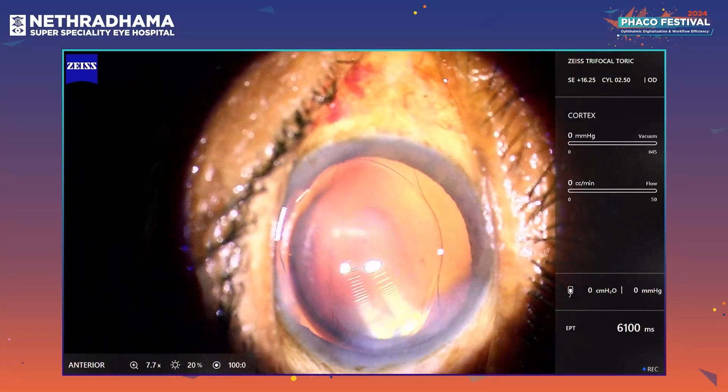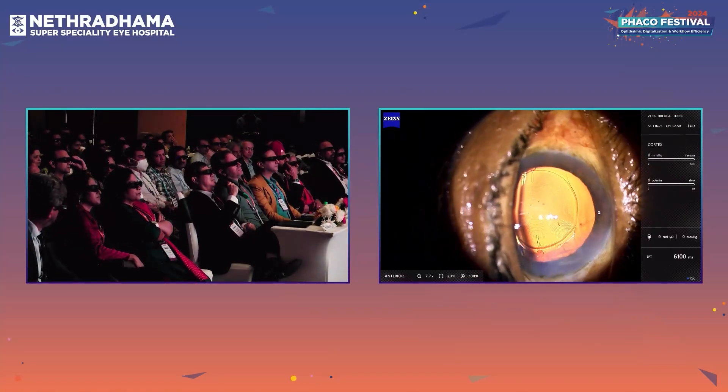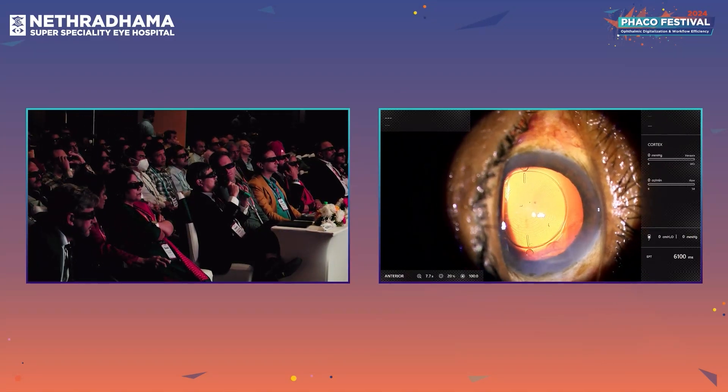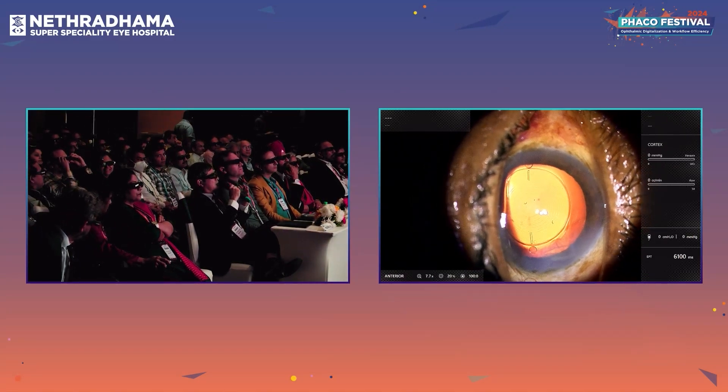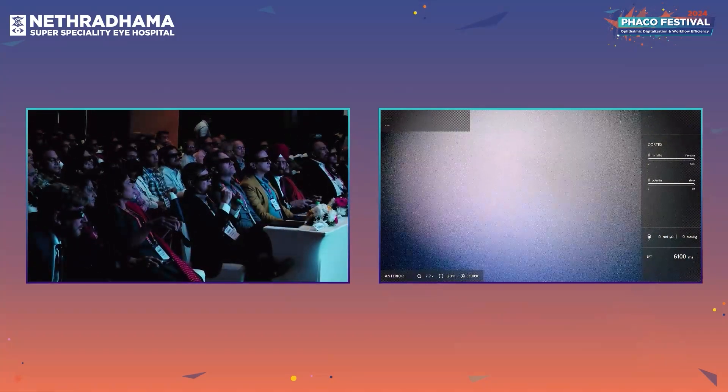That was beautiful surgery. Can I ask you one question regarding the four-chamber technology on the Quatera machine? It's supposed to make the anterior chamber much more stable with much less surge than other machines.